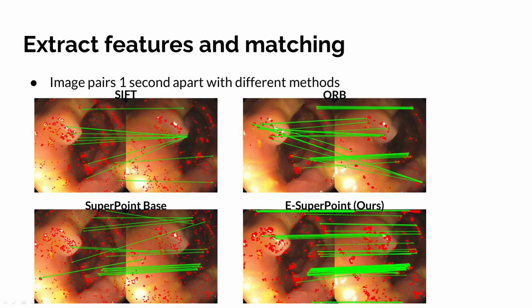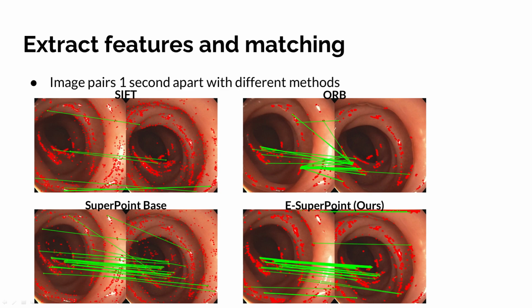In these experiments, we extracted features and matched image pairs 1 second apart from each other, with various well-known methods in this application. Matching in this environment is a challenging problem. Methods sometimes succeed, but usually struggle.